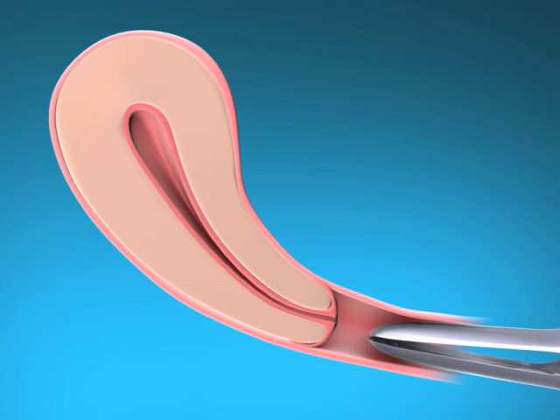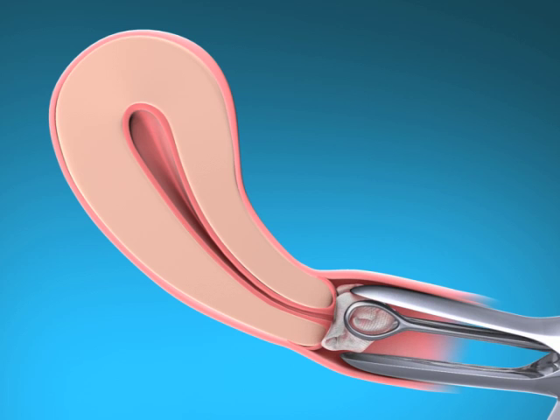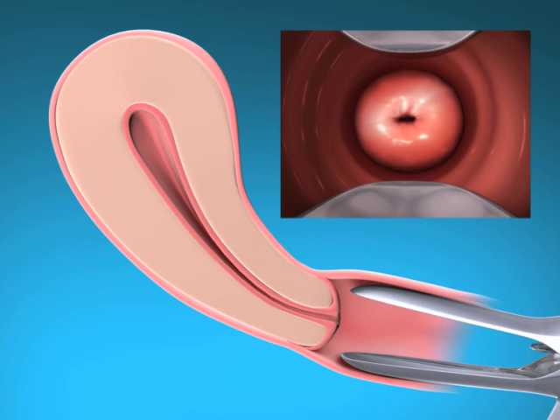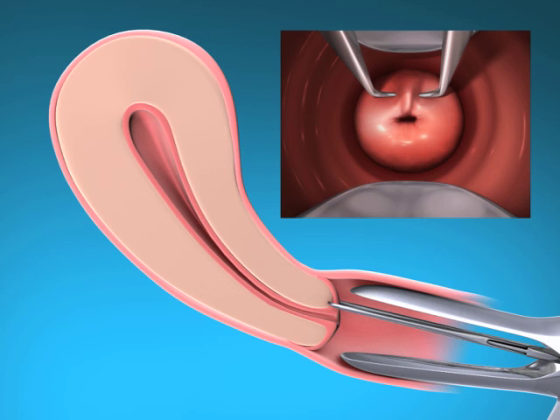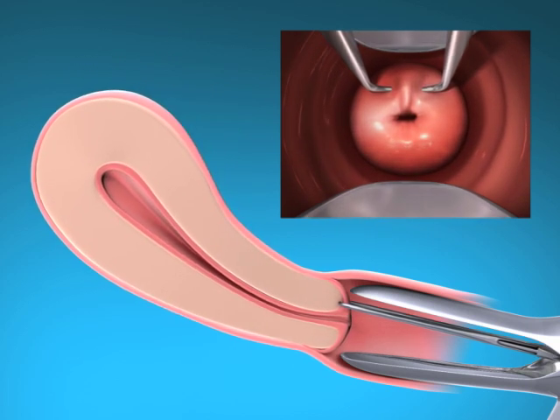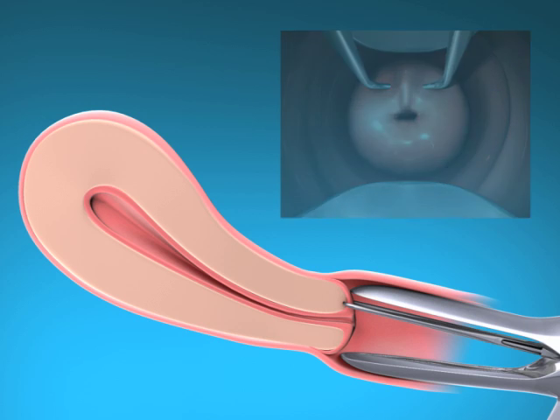Insert a speculum, visualize the cervix, and then cleanse the cervix and vagina with a suitable antiseptic solution. Grasp the anterior lip of the cervix with the tenaculum to stabilize the uterus. If the uterus is retroverted, it may be more appropriate to grasp the posterior lip of the cervix. Gentle traction on the forceps can be applied to straighten the cervical canal. The forceps should remain in position and gentle counter traction on the cervix should be maintained throughout the insertion procedure.